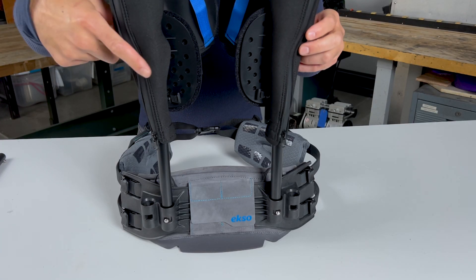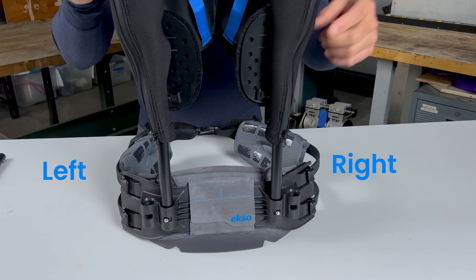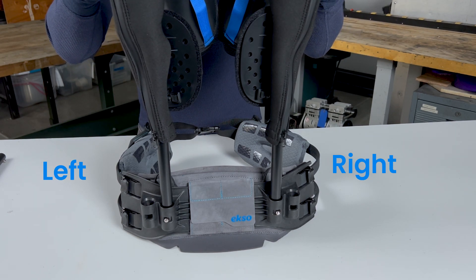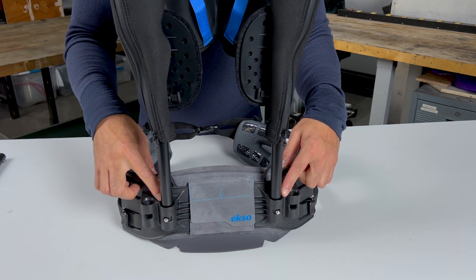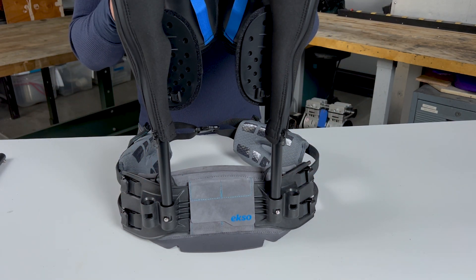Look for the L and R indicated on the back of the torso pads. These should be on the left and right sides of the user. By default, the arm assemblies should be installed in the inner lug sockets.